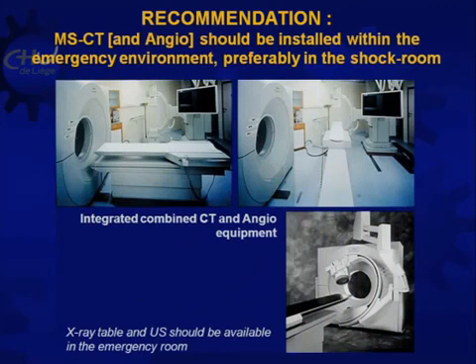the emergency environment. A couple of years ago, we developed this prototype, which is an integration of the CT and angiography. At the beginning, there was a movable table. And now we have a very compact solution where you have a complete angiography together with the CT.